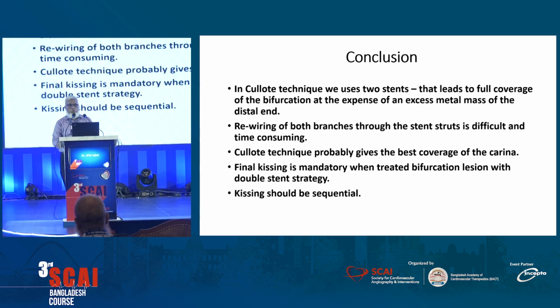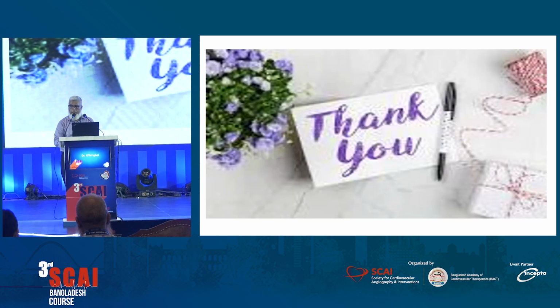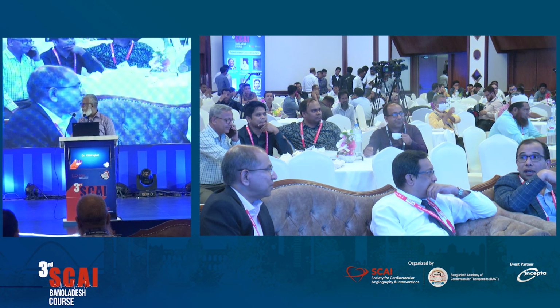Conclusion: in culotte technique we use two stents, which leads to full coverage of the bifurcation at the expense of excess metal mass at the distal end. Rewiring of both branches through the stent strut is difficult and time consuming. Culotte technique probably gives the best coverage of the carina. Final kissing is mandatory when treating a bifurcation lesion with a double stent strategy. Kissing should be sequential. Thank you.